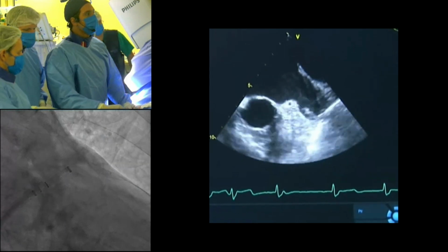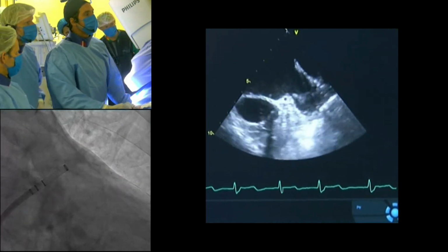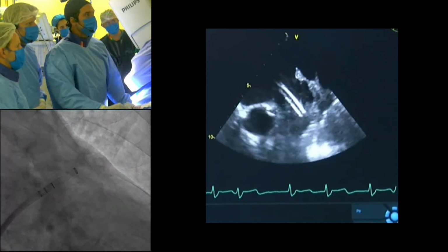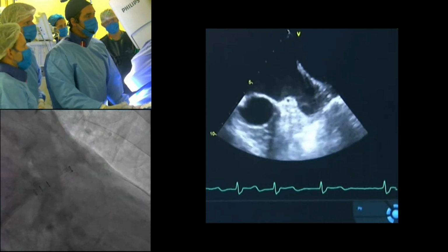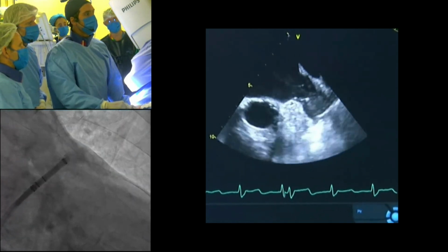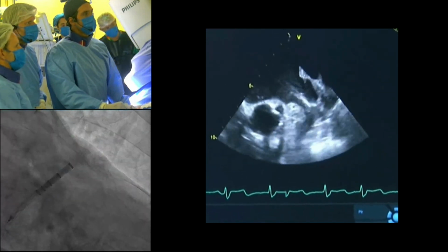Okay, guys, so we're driving the device through the delivery catheter now. Tell us what you look at, Felipe, on that marker, and what do you do with your hands? Yeah, I keep a little bit of pressure anti-clockwise. That's good. So we're going to go with the device until our last band marker, which you can see, the distal one. We can always pull back.